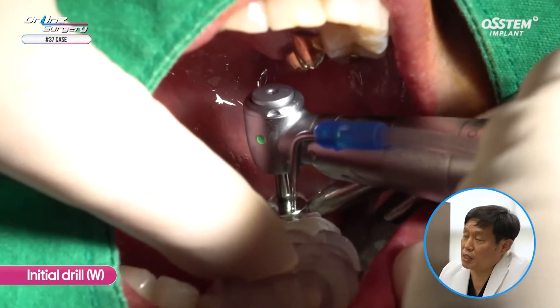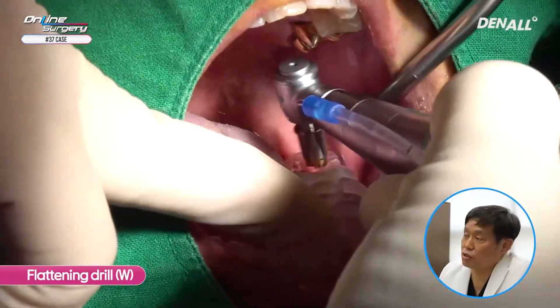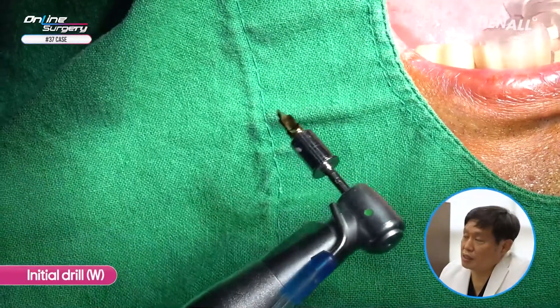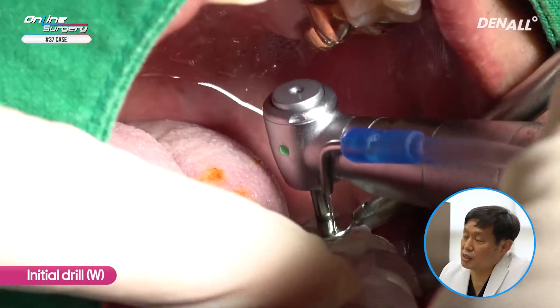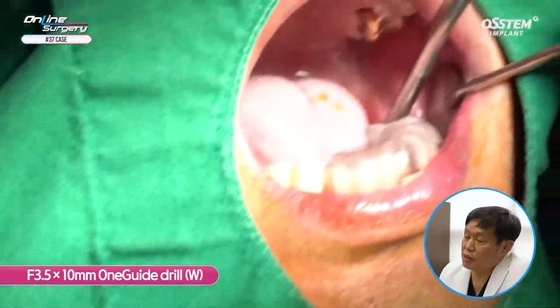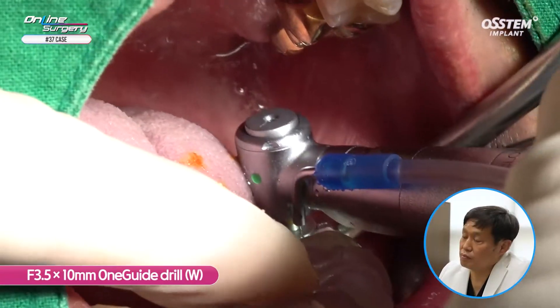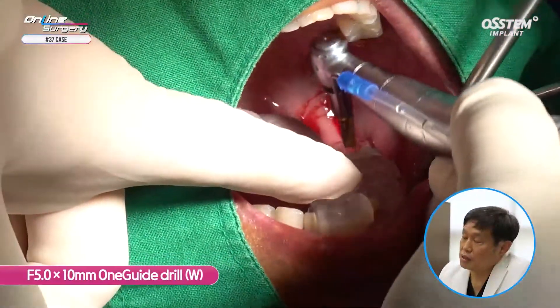I planned for placing the implant deep. If the initial drill doesn't go in full length, you can use a flattening drill to prep the superior part. The flattening drill is used and I check whether it's achieving full-length drilling. Then initial drilling is done again in full length. If the initial drill does not go in fully, use the flattening drill. Then the 3.5 by 10 mm one guide drill is used with pumping action, followed by the 5.0 by 10 mm one guide drill.